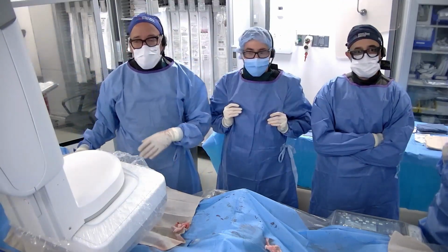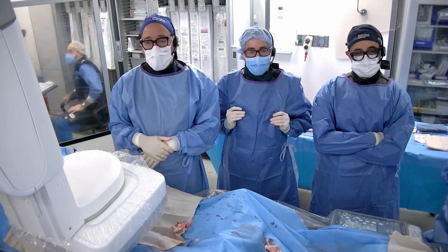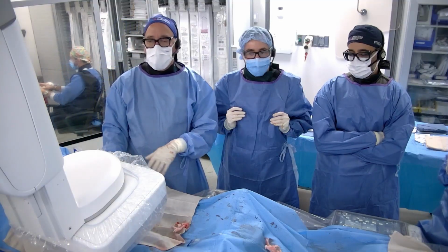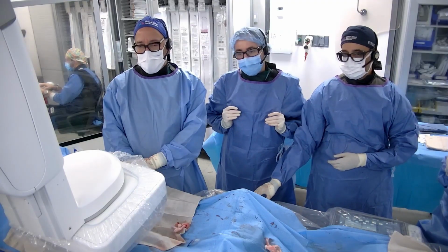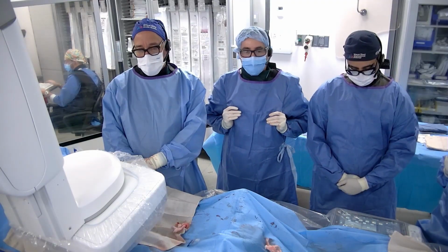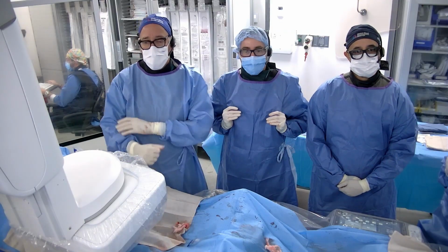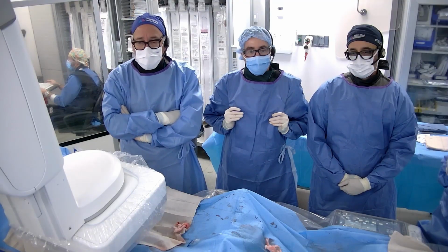So just out of curiosity, what diameter systems would people feel comfortable doing? I think Vanita said 4 for the TP trunk. Is that routine that people are using 4 millimeters for either PrEP or IVL for the TP trunk? Yeah, I think I get pretty aggressive in oversizing, and if IVUS shows that it's at all bigger than 3 millimeters, I'll probably pull a 4. Any other thoughts on how you treat that?